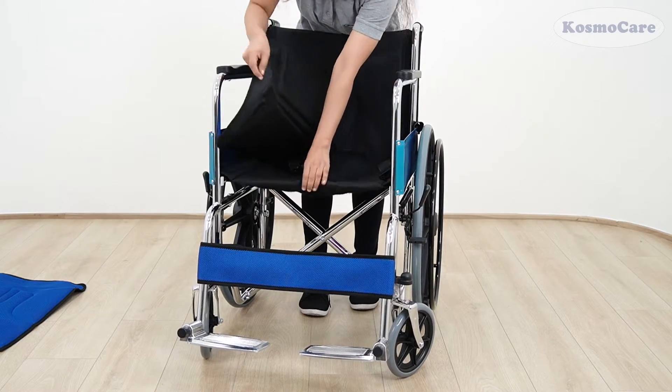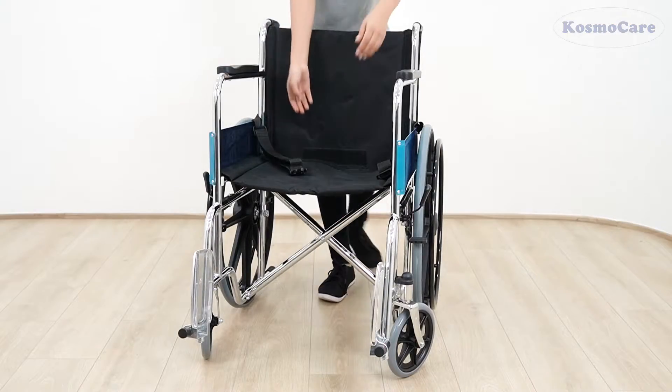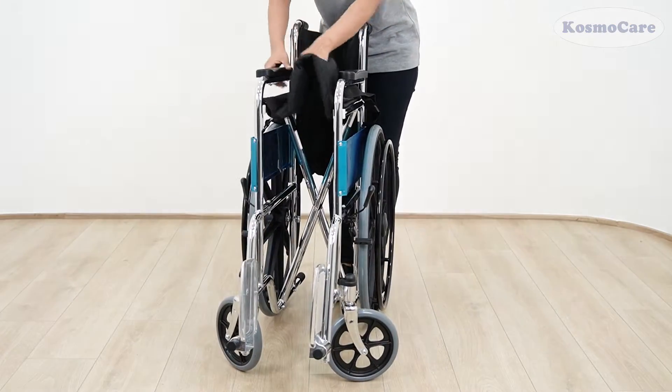If you wish to transport the wheelchair or store it when not in use, simply remove the mesh cushion seat, flip up the footplates, and pull the seat up to fold the wheelchair.